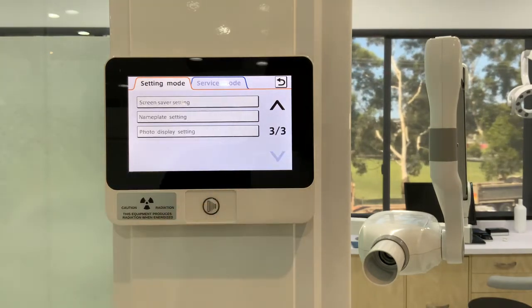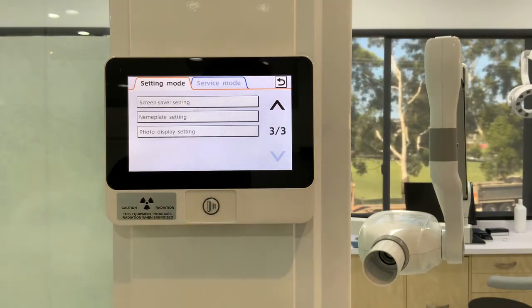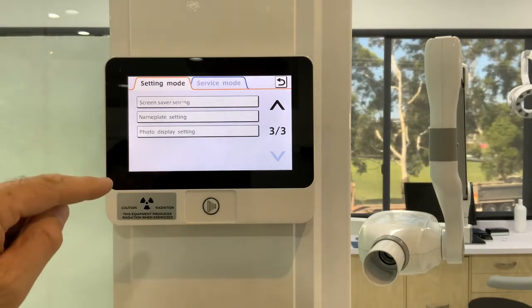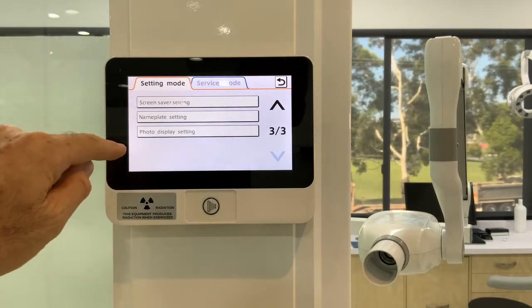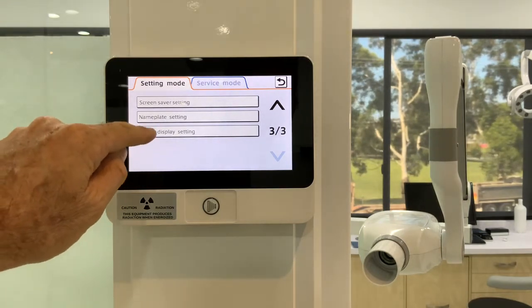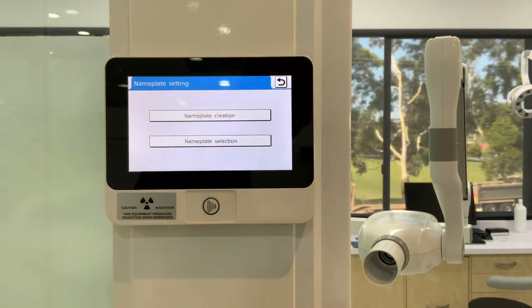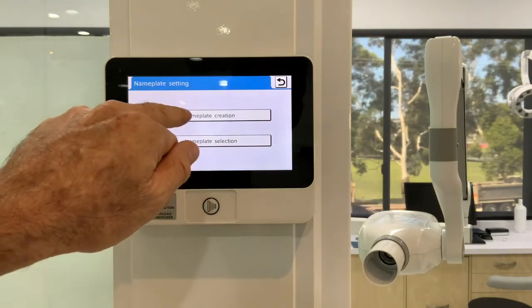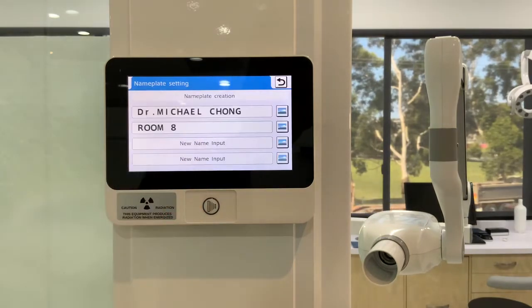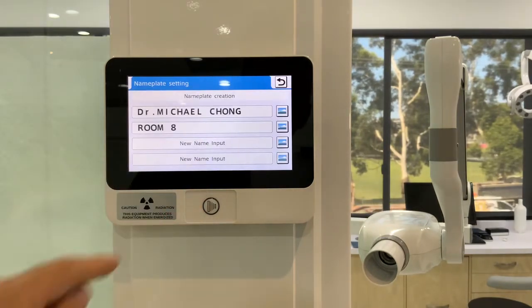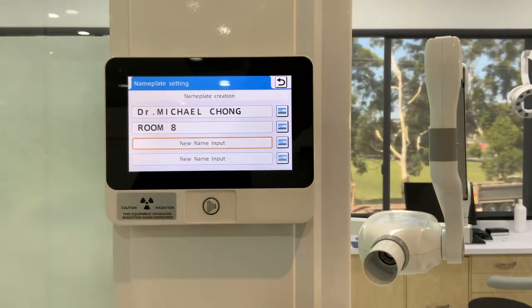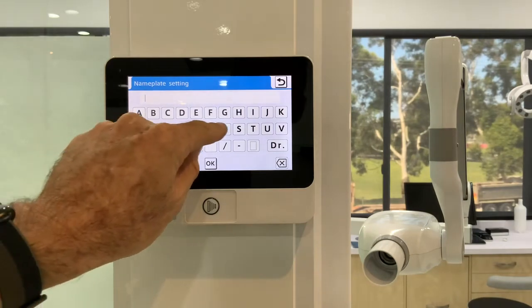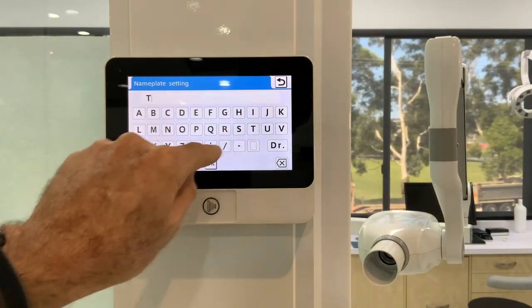Page three is where there are some settings that are a little bit of fun and very functional as well. Nameplate settings — we can have either nameplate selection or nameplate creation. If I want to put a new nameplate in there, I can just put — let's call this one "test".